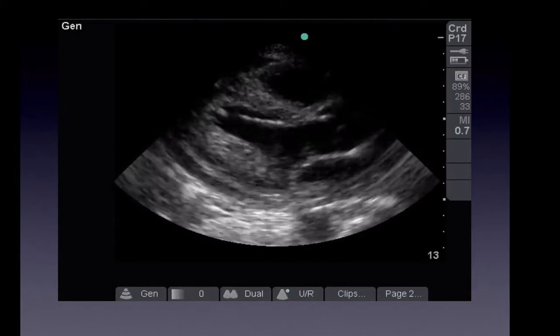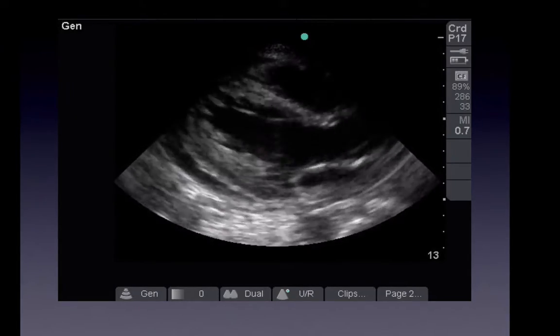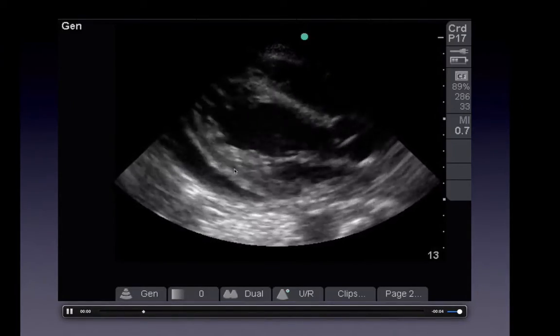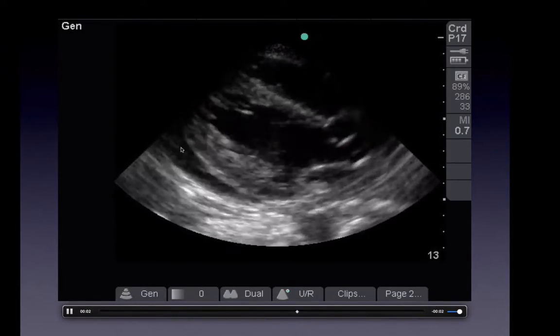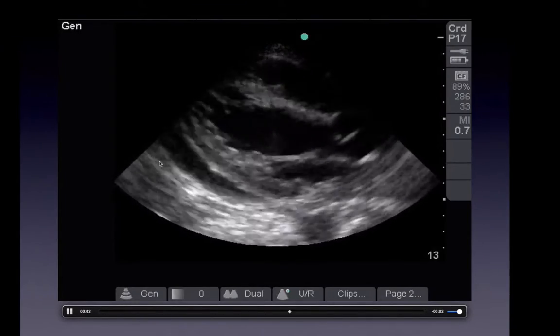So let's move on to some clinical scenarios here. Tamponade, obviously, is a clinical diagnosis, but if you have your ultrasound, you're going to take a look at the heart. And in order to have tamponade, you need a pericardial effusion. We've talked about fluid, and fluid in ultrasound shows as anechoic, having sharp edges, right?